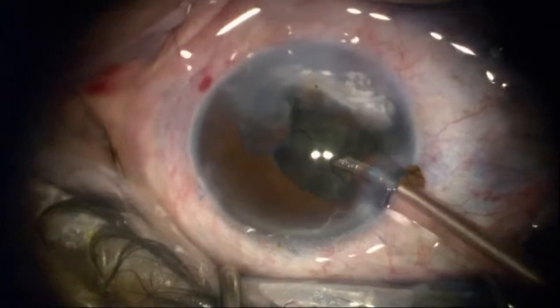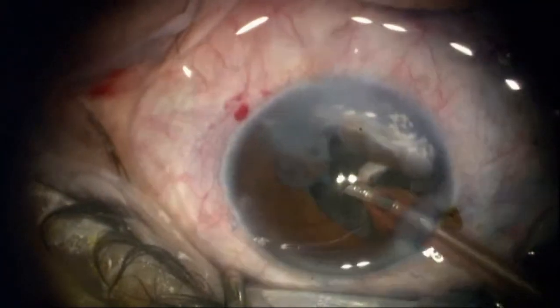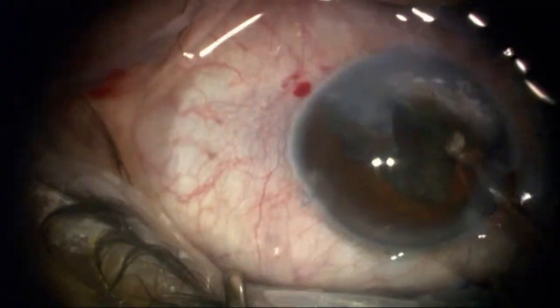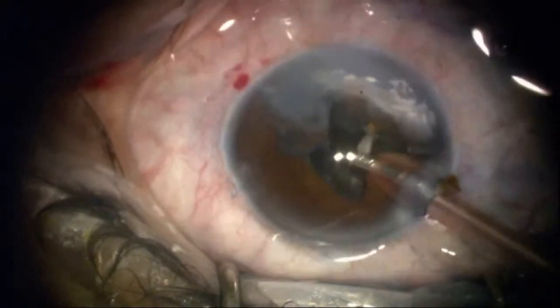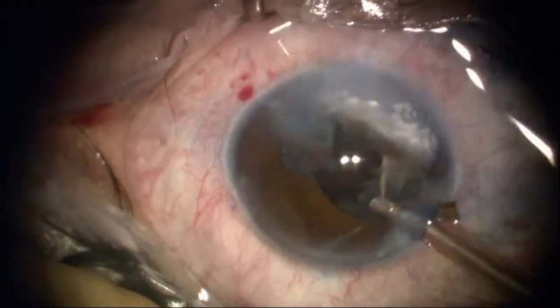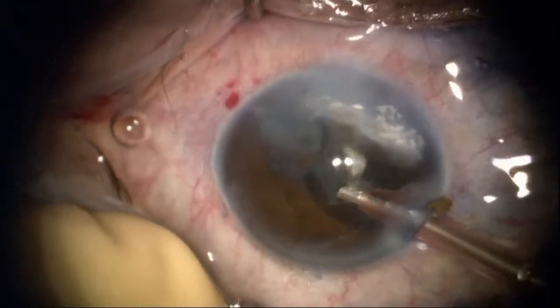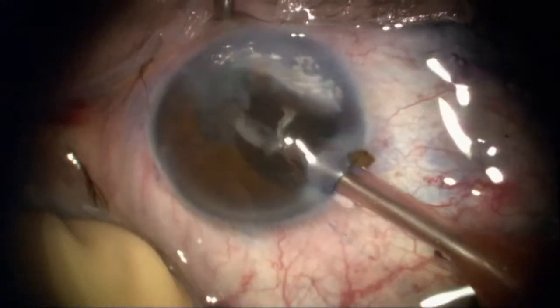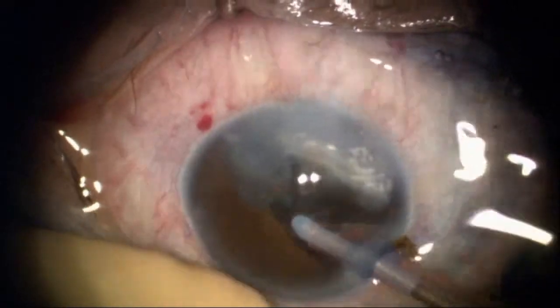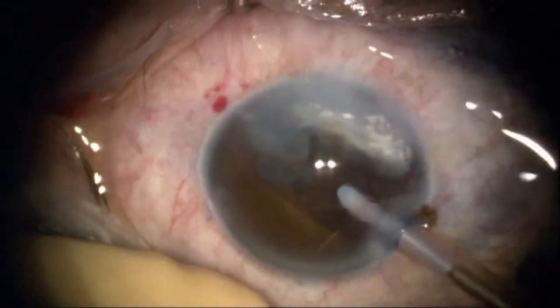I'm going to do a lot of cracking here, using a one-handed technique to keep the chamber deep and reduce loss of fluid through the paracentesis. You can see a little bit of a tag of iris scar — I'm not worried about that because it's not really viable tissue. I'll come back and get that later with a Van Ness scissor, but for now I'm taking the nucleus followed by the epinucleus.